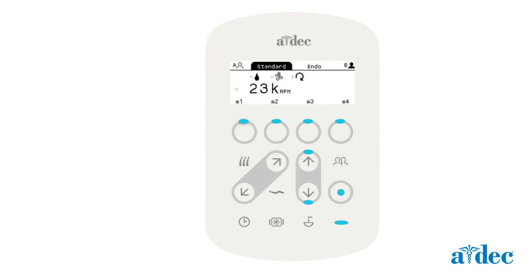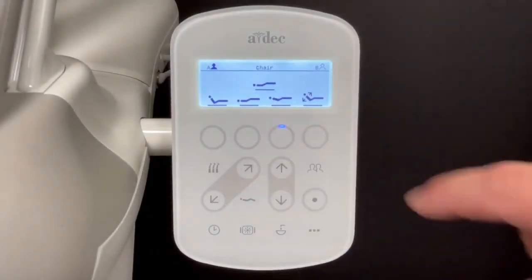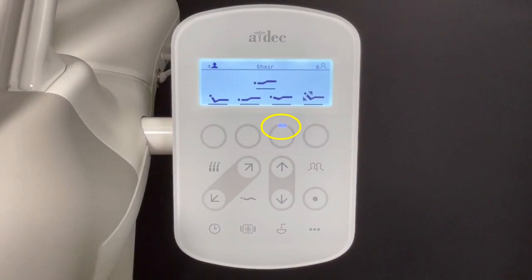On relevant screens, some buttons will illuminate to indicate equipment status and available choices. These lighted buttons include the soft keys, the up and down arrows, the adjustment button, and the options menu button. This demonstrates how soft keys are used to move the chair to a preset position. Notice when the preset is selected how the soft key lights up. When the chair reaches the preset position, the button stays illuminated to indicate that the chair is currently in that preset position.